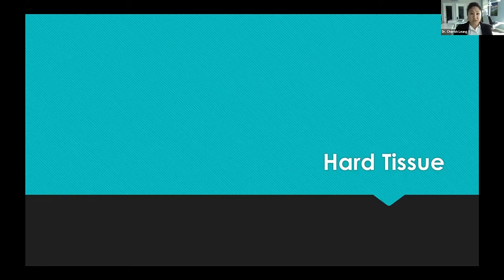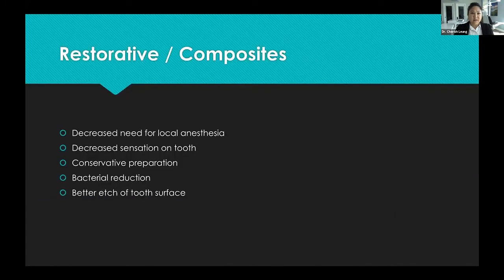So you can do hard tissue as well. Like I said, I use it all the time on hard tissue, especially for kiddos who can't stand the vibration of a handpiece. I see a lot of special needs kids. A lot of them who are high functioning just don't like the vibration of a handpiece. So this is a lot more comfortable for them, especially if they don't hear any of the sound; we use headphones and noise music.